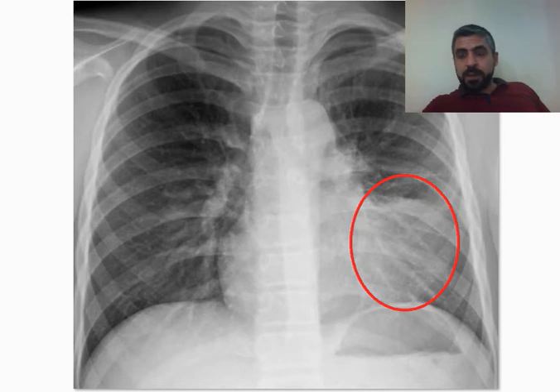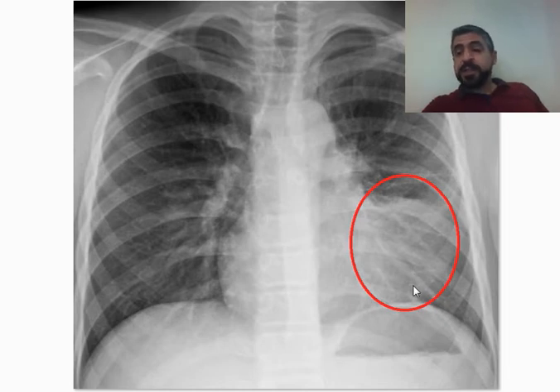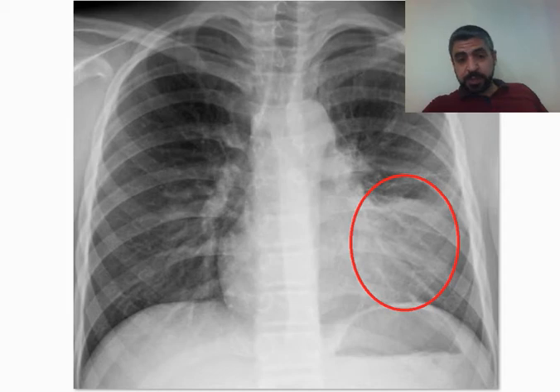What's going on here? Everything looks quite good except some increased opacity in the left lower zone, associated with loss of sharpness of the left cardiac border. This indicates lingular pneumonia, as we said previously.